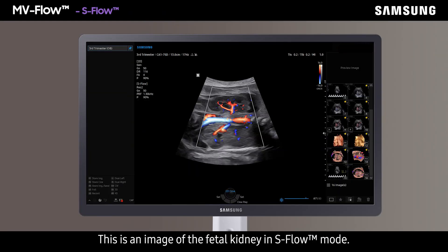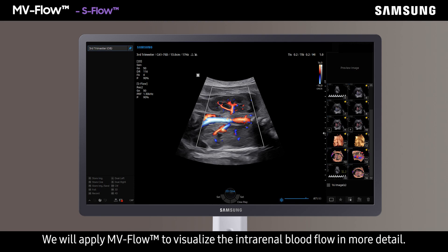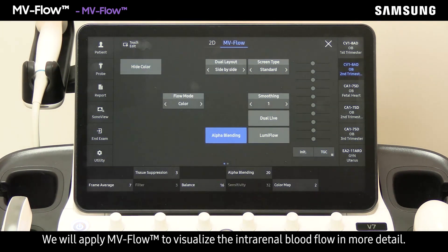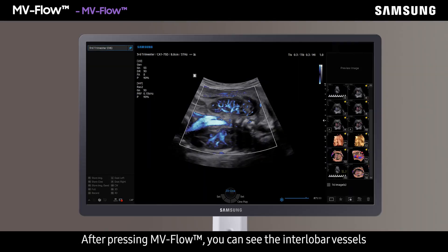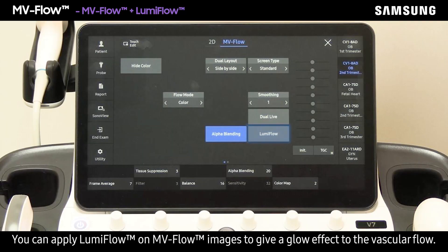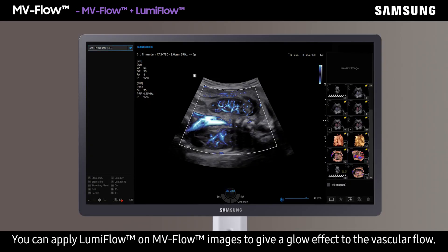This is an image of the fetal kidney in S-flow mode. We will apply MV Flow to visualize the intra-renal blood flow in more detail. After pressing MV Flow, you can see the interlobar vessels as well as other micro vessels. You can also apply LumiFlow on MV Flow images to give a glow effect to the vascular flow.